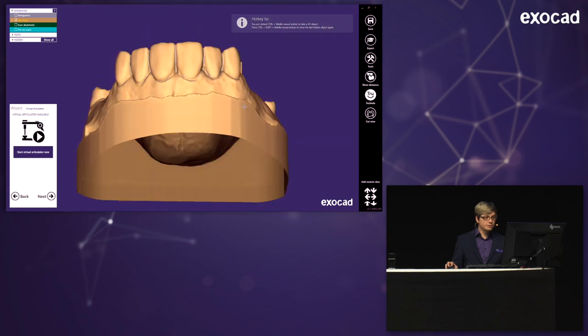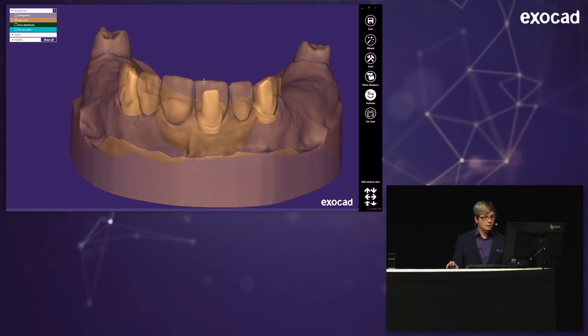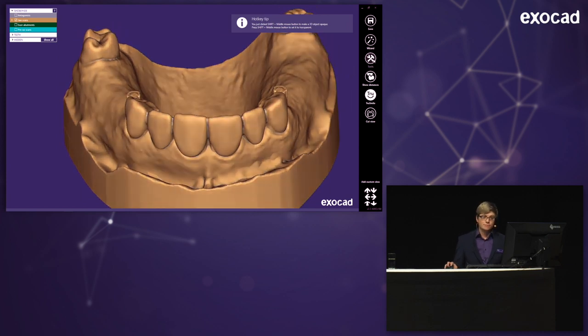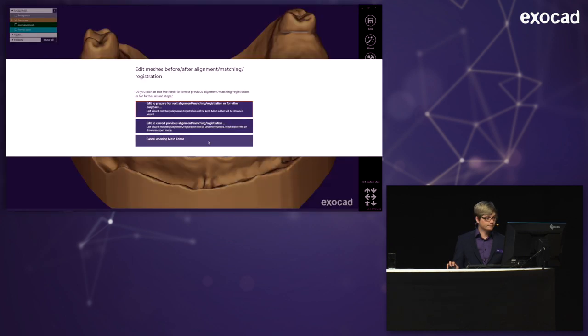And you see in the model, because those are merged, there's parts floating inside, like the old dies. I can correct this. I won't need to correct this, but I'm still going to show you how to do this. I'm switching to the expert mode. Because maybe you want to use this for some other application, like the model creator, where this could pose a problem. And now I'm right-clicking and choosing edit meshes. And it actually asks me which one I want to change.